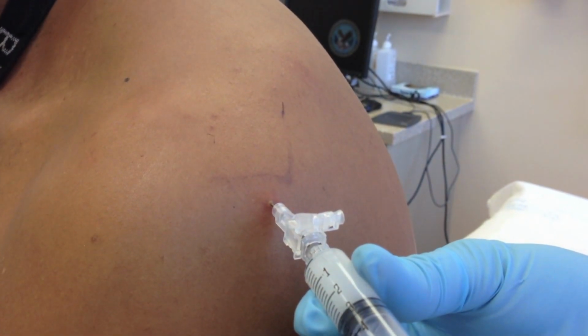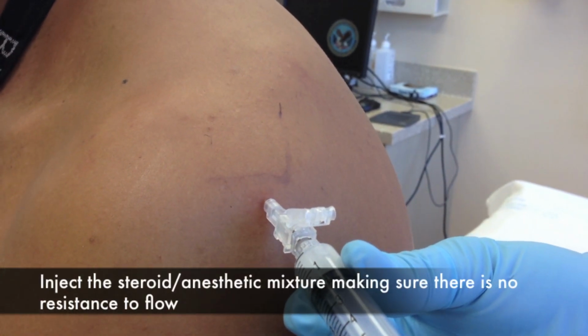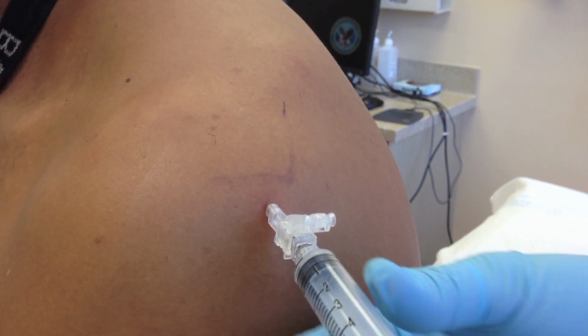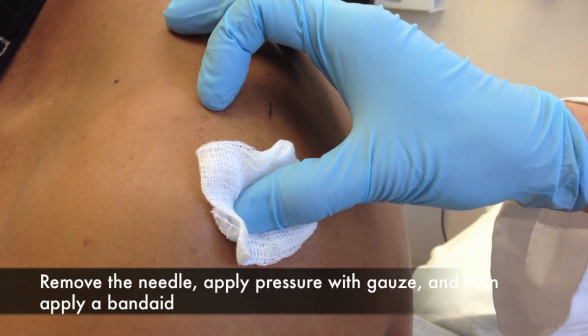Inject the pre-drawn steroid anesthetic mixture as long as there is no resistance to flow. Steroid injected directly into a tendon may cause tendon rupture. Remove the needle and apply pressure with a gauze until any bleeding has stopped. Then apply a Band-Aid.